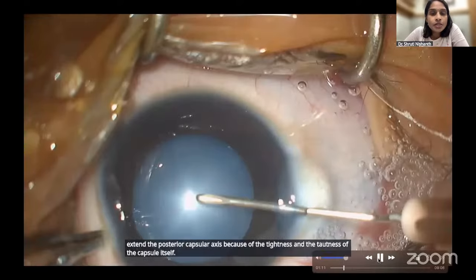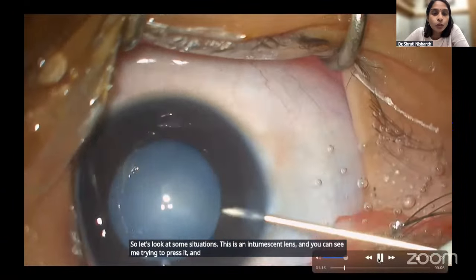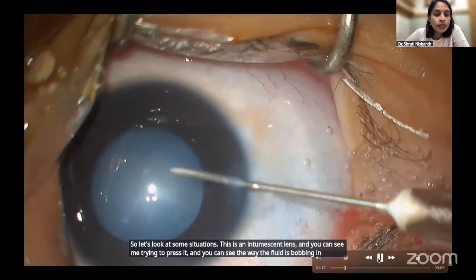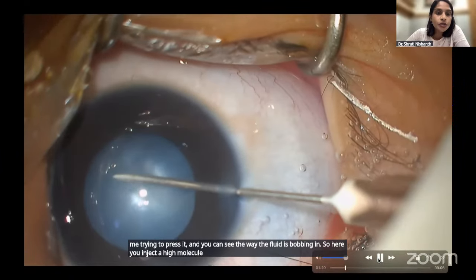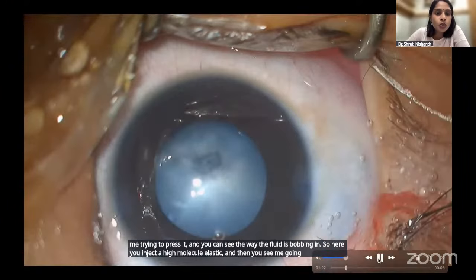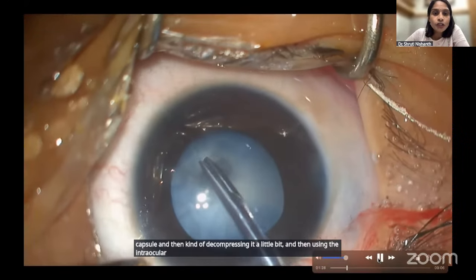So let's look at some situations. This is an intumescent lens, and you can see me trying to press it, and you can see the way the fluid is bobbing in. So here you inject a high molecular weight viscoelastic, and then you see me going right through the capsule and then decompressing it a little bit, and then using the intraocular rhexis forceps to slowly navigate around.